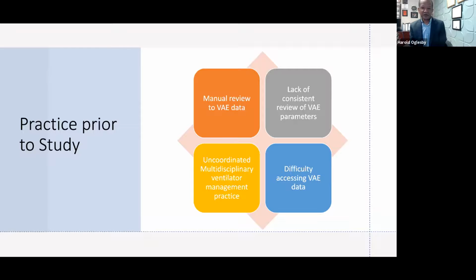And anytime you put a human into the evaluation, you can have errors, you can have bias, and you also have to have that person be available to do it. And we all know being tasked with one thing, it would be easy. But when you have a person that's not just one assignment, they have multiple assignments, it's hard to keep accurate data and timely data versus the automated system.